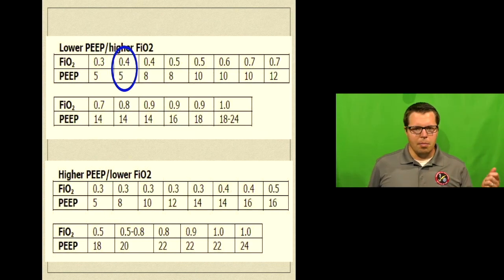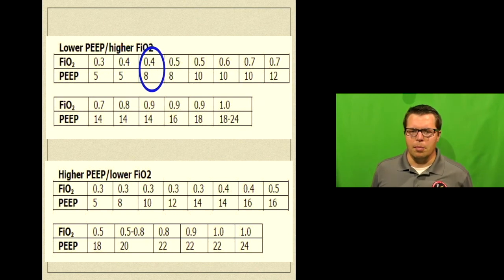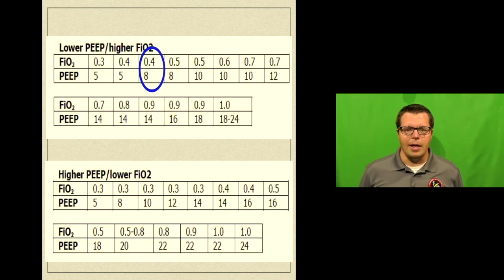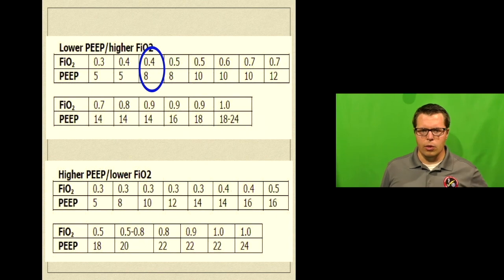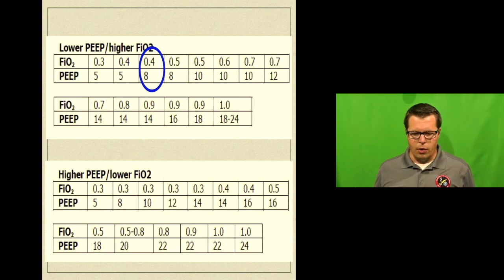Instead of bumping up his FiO2, I am going to bump up his PEEP, and I'm going to go from 5 to 8. And see how he does. And again, I'm going to give that a couple of minutes, a minute or so at least, to equilibrate, let those lung segments open up, let perfusion get back out to his finger there before I make a whole lot of changes, unless he is, again, peri-arrest. We're going to let that sit, marinate for a minute.